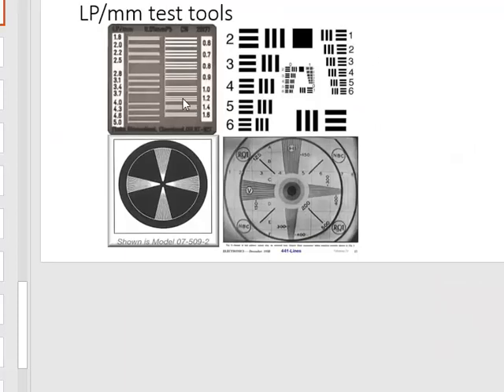So again, we're looking at things that have very low line pairs per millimeter, so spatial resolution. And the contrast then becomes even more important, so that we can separate those things out. If contrast resolution is poor on things with very low spatial resolution, where our line pairs per millimeter blend together, then it compounds the problem.